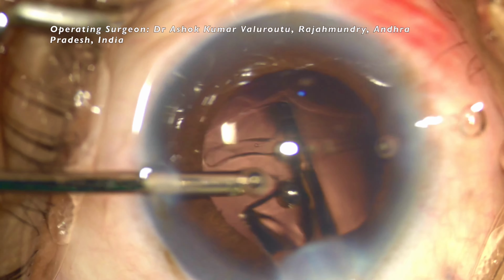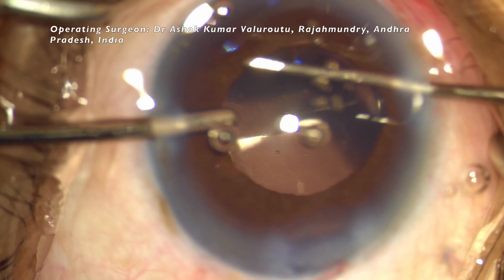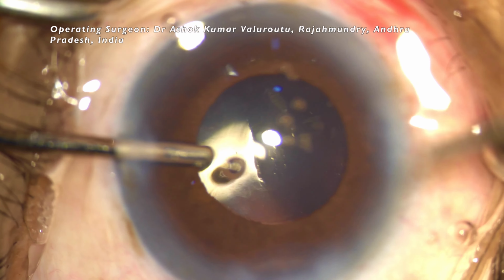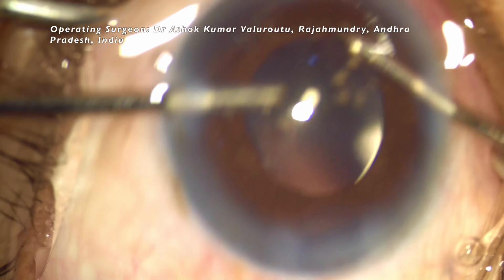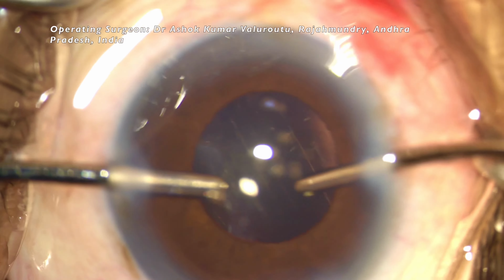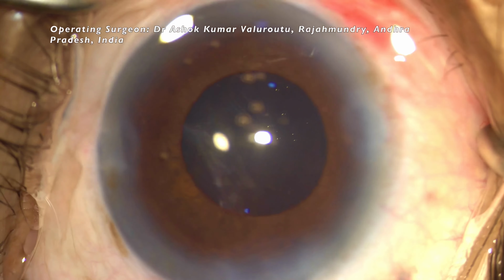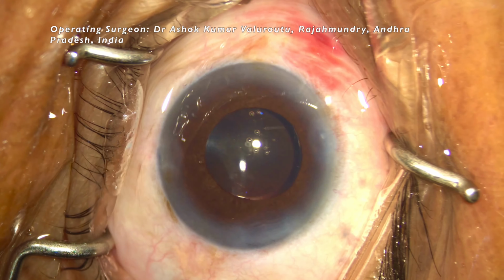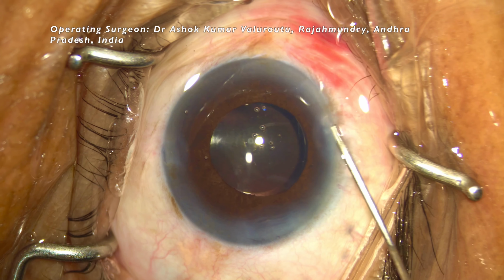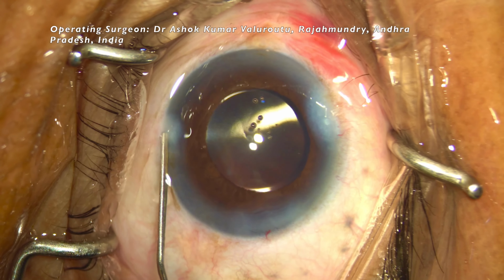With the irrigation cannula, making sure that the anterior chamber is fully filled, now the IOL is implanted, and now the IOL is dialed with a Sinskey hook. After the IOL is properly in the bag, the aspiration port is inserted and any visco that is left is aspirated. Making sure that no visco is left behind, we close the case with intracameral moxifloxacin and stromal hydration, making the case airtight. And with this we close the case.